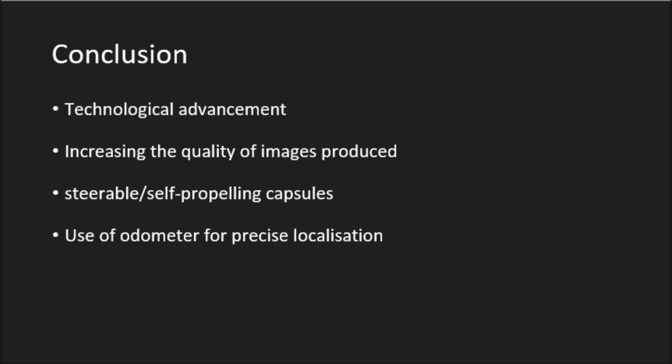As technology rapidly advances and knowledge is broadened, clinical applications of capsule endoscopy will also continue to progress and improve. Advancements to capsule endoscopy, such as the use of quality multi-element lenses and adaptive illumination, permitting an enriched image clarity and wider angle views, provide a promising development. In the near future, we will begin to see the development of steerable capsules and even self-propelling capsules.